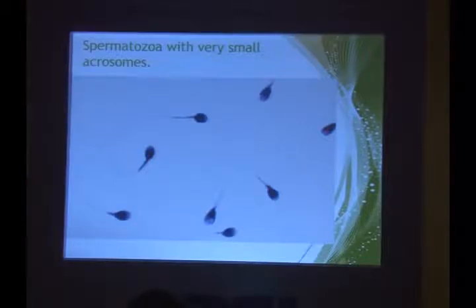So looks-wise it looks fine, nothing majorly abnormal. Even this sperm, hardly any acrosome. So if you are careful, you will see that there are acrosomes, but they are very poorly developed. I am trying to show you from gross to very minor abnormalities so that you are well qualified to report them.